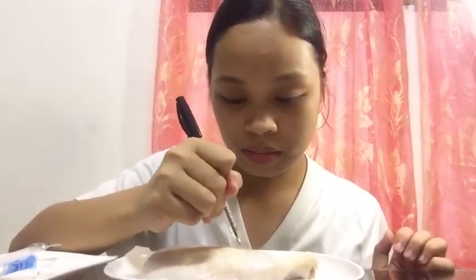And I'm going to apply hand hygiene. I'm going to remove the cotton ball. Then I am going to encircle the site. Then I am going to apply hand hygiene again.